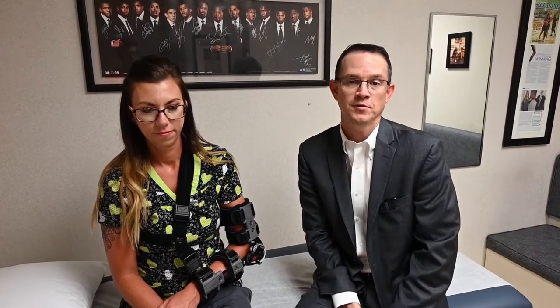Hello and welcome to another edition of orthopedic sports medicine patient educational series with Dr. Adam Durecki. In this video, we're going to review the post-operative elbow brace used following a distal biceps tendon repair. To do this, we've incorporated the help of Carrie from the office. If you've had a distal biceps repair already, then you've probably met Carrie either in the operating room or here in the clinic.